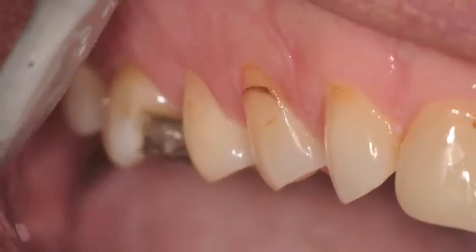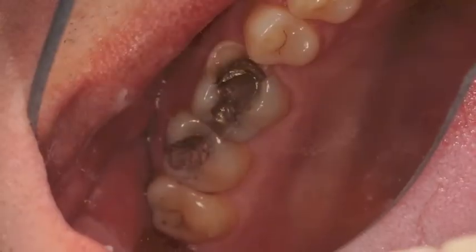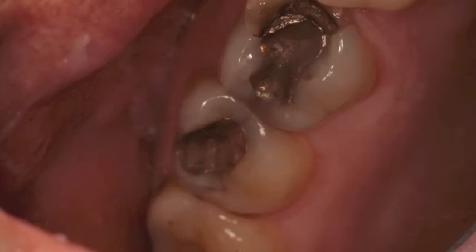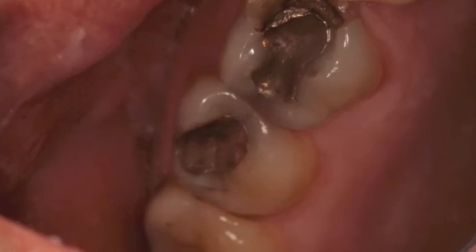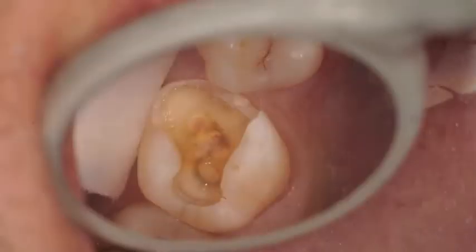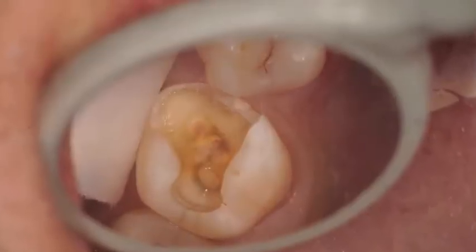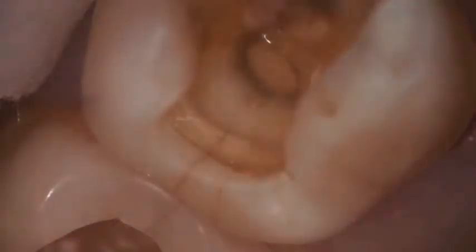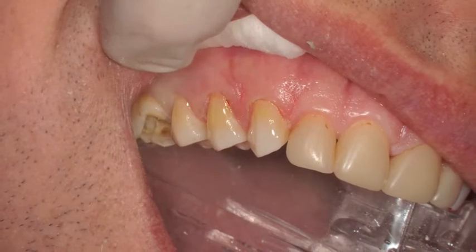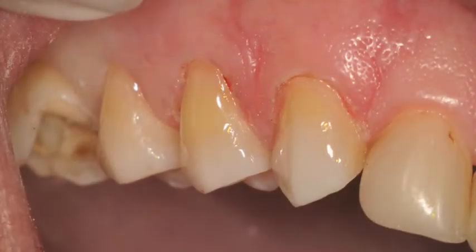We had some buccal restorations where a gingivectomy was done, and some amalgam restorations and occlusal decay which were replaced. There was an occlusal restoration very deep on the second molar, a fractured first molar which had a full crown preparation. You can see the amalgam restoration removed. Cracks on the distal marginal ridge were observed, and here are the restorations on the buccal completed of the premolars and canine.